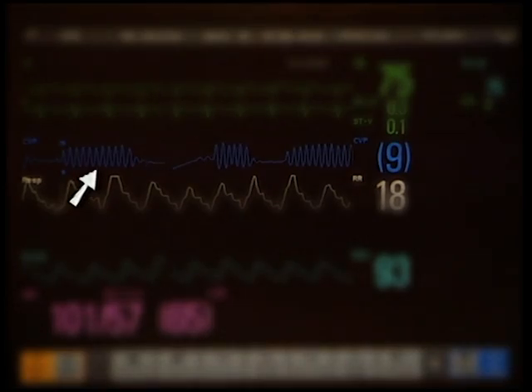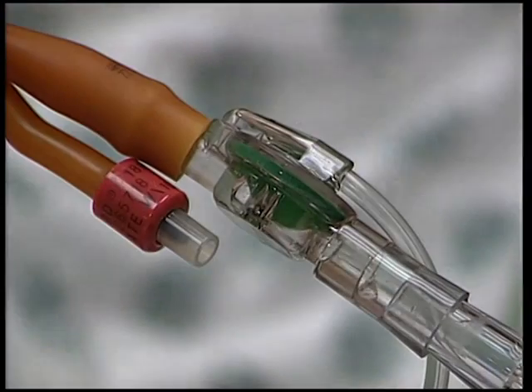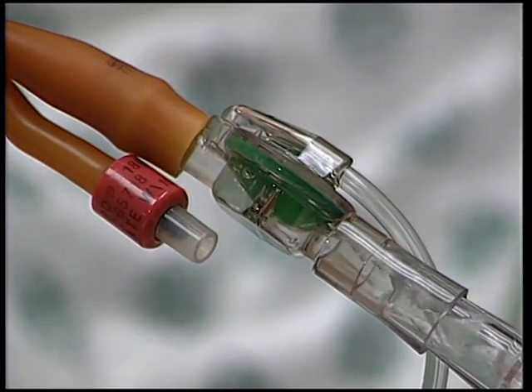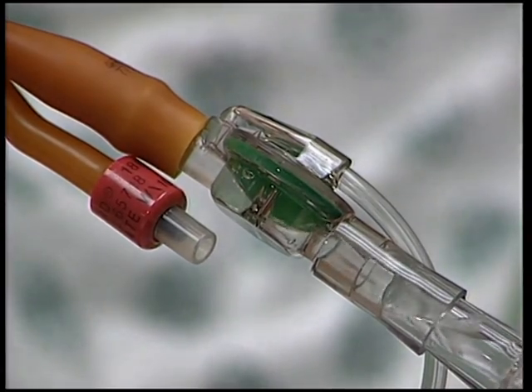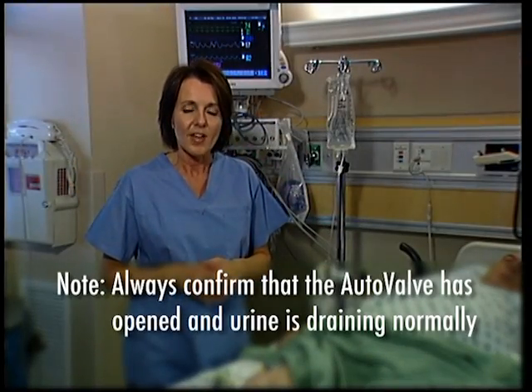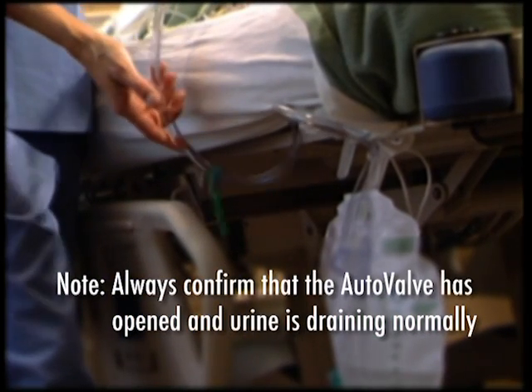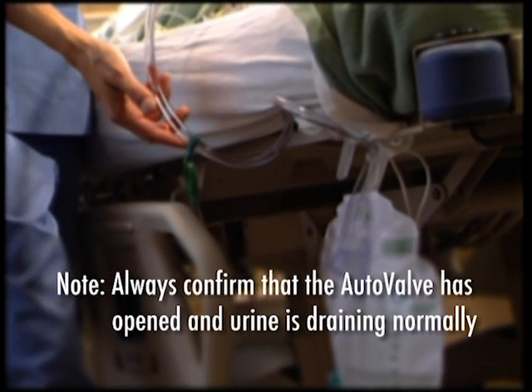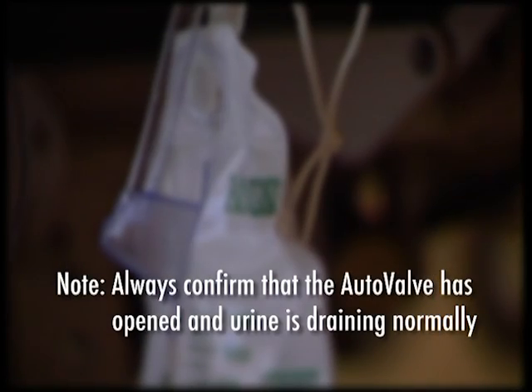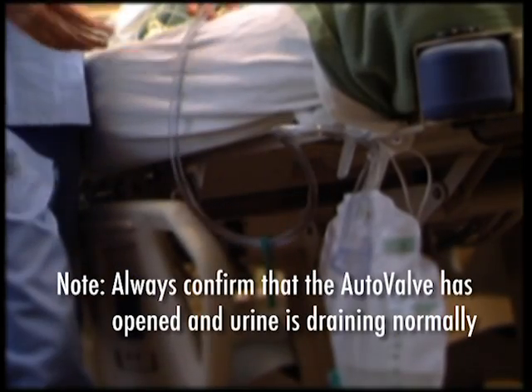In approximately two minutes, the auto-valve will automatically open, the fluid will drain, and the pressure will decrease to zero. If the pressure does not completely decrease to zero, there may be some fluid remaining in the drain tubing. Drain the fluid into the drainage bag and the reading should go to zero, indicating the AbVisor valve has opened into the drain position.